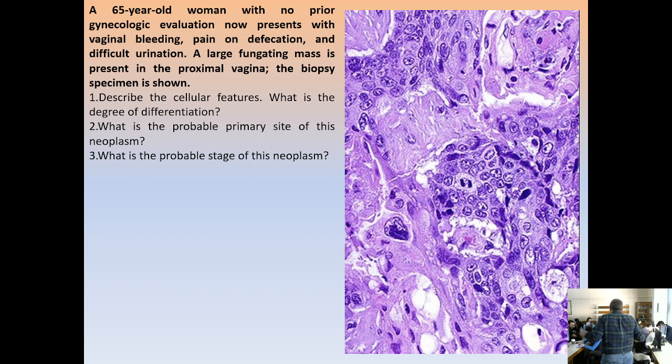It's not an adenocarcinoma. Other cells acquire pink cytoplasm as they grow, and finally they become apoptotic, and we see that they are darkly pink, and they have some follicular configuration when they are terminally differentiated. Do you remember these cells? Which tissue has these cells? Yes, please? The keratinocytes, excellent. Squamous epithelium.